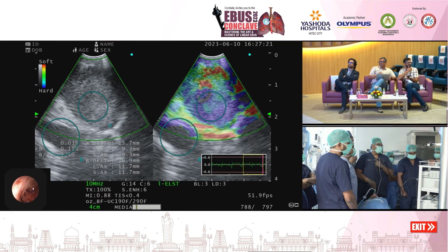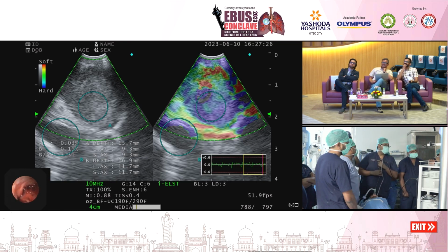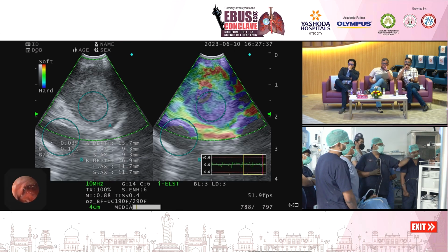So Pratik, are you able to do it? Yes, sir. So basically we have done the strain ratio here. Can you explain for people like me who don't know it? So here you can see at the bottom left area a B by A ratio. In this case it is 3.5.